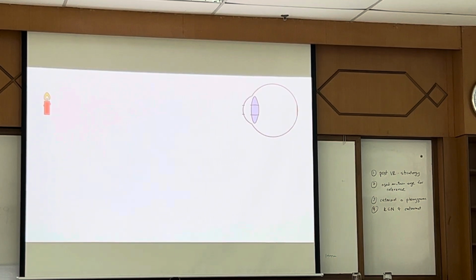Just now we put the minus lens, then the patient will view the optotype. At which distance is the optotype? Okay, I will explain. Okay, thank you, Doctor.